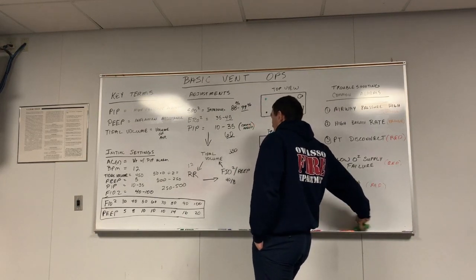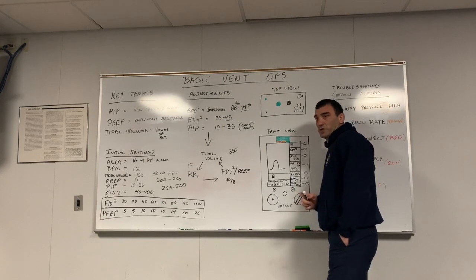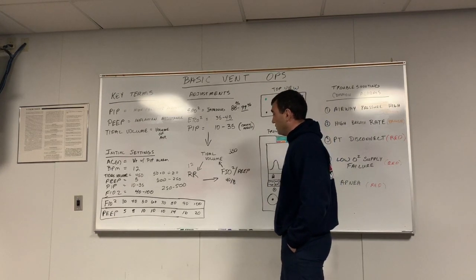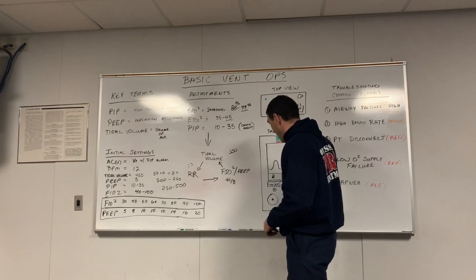And let's say that it drops down and it's back into my range. So we don't need to make any more adjustments. I adjusted my treatment, the patient still responded, and we're okay. But what if the SpO2 does drop? Remember, these are proportional. So I have choices.